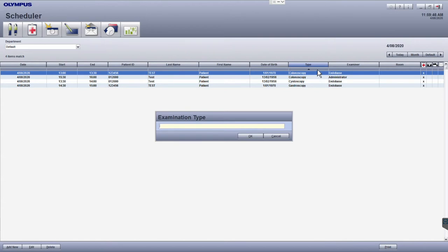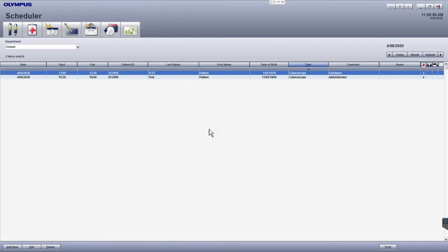For example, if you only want to see a particular type of examination being done in this list, you will be able to set a filter for that particular column. Just be wary that if a filter is set this will hide the other information. So if sometimes you find that you can't find a particular examination that should be on this list, it's always good to check whether there are any active filters.